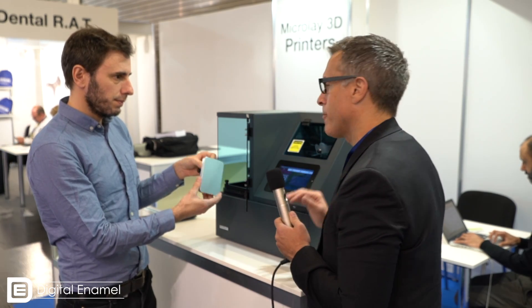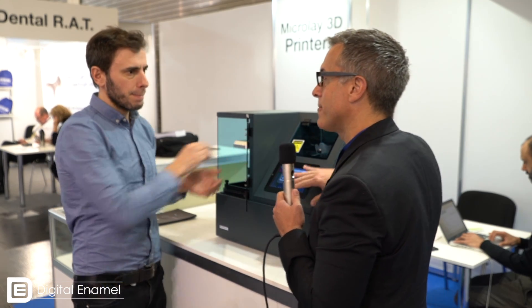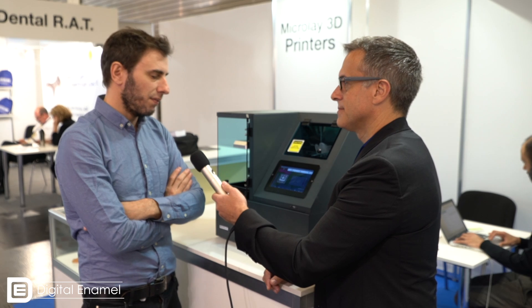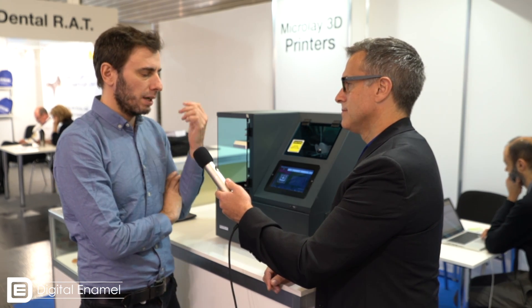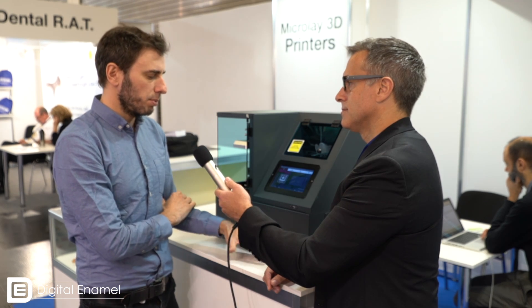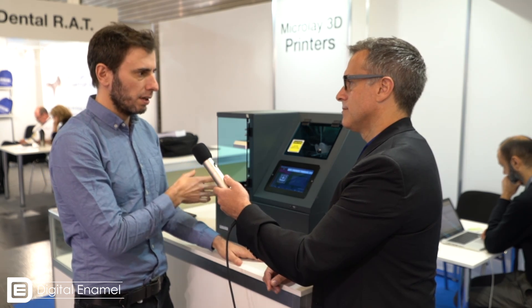You've got a number of profiles for different resins. Can you tell me a little bit about some of the resins you recommend for this printer? We have an open materials policy. As long as we come up with new profiles, you will be able to print with this printer. We've already profiled NextDent resins — most of them. So you can just download from our side, import to the machine, and then you will be able to use it.